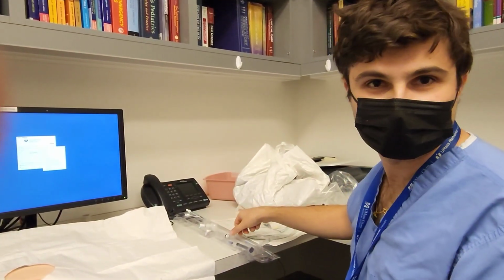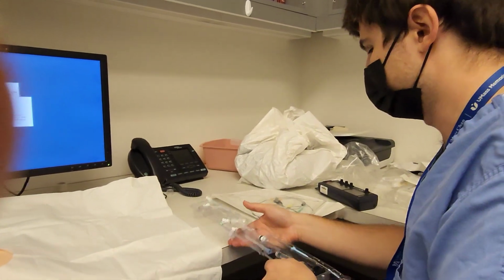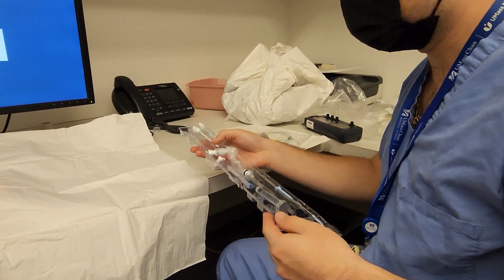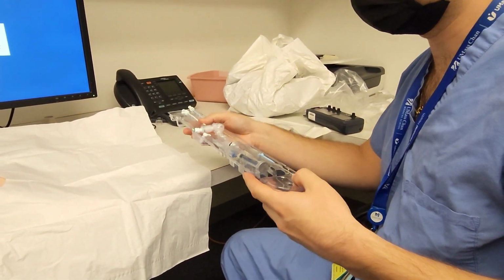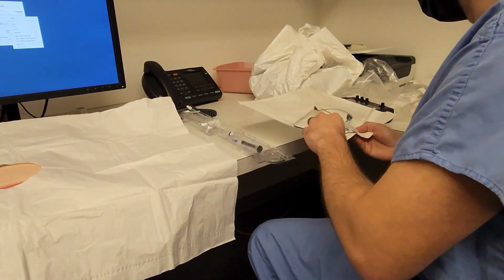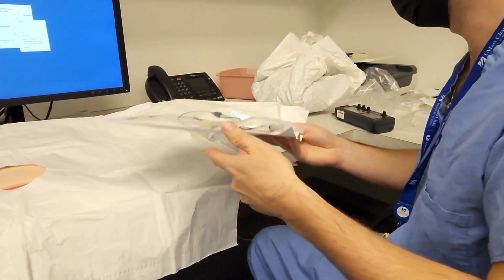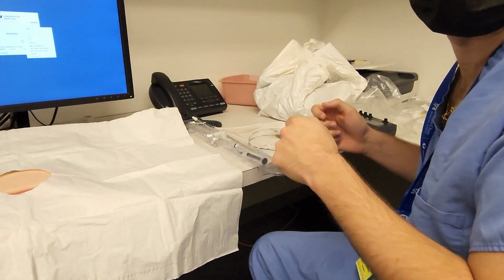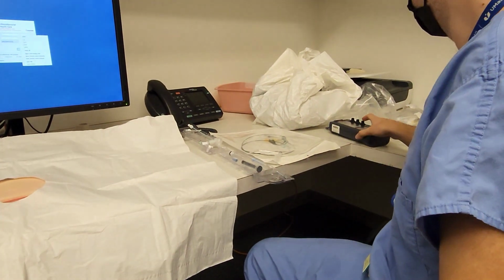Okay, so I'm going to take you through the transvenous pacer kits. The ones upstairs are the 6 French introducer sheaths, and the introducers themselves are on the code cart. And then it's a 5 French pacer with balloon, which is in another kit. And then there's extension cables, which are also in the little box above the code carts upstairs.